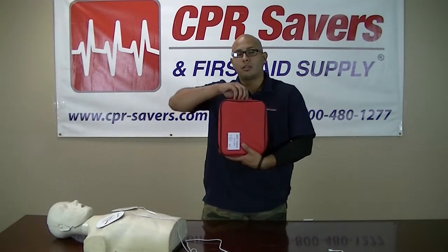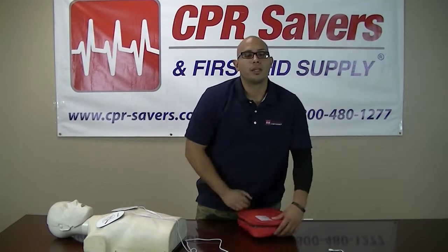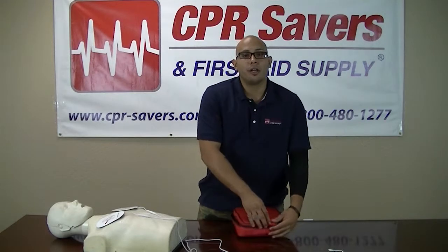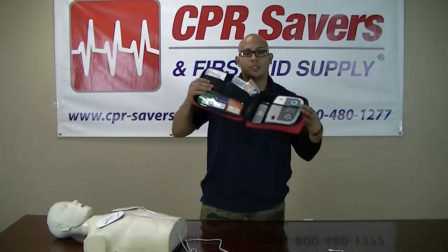The XFT trainer comes in a convenient red carrying case with a handle. Inside the carrying case you will find the XFT trainer along with all the accessories you will need to operate it.